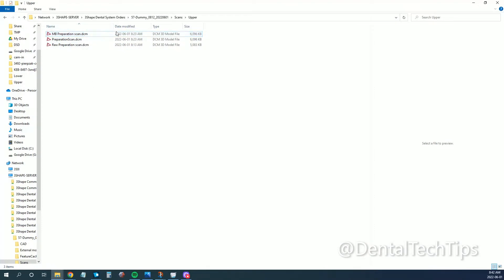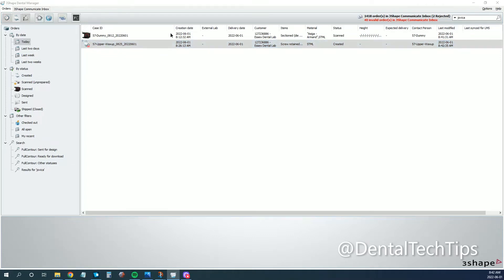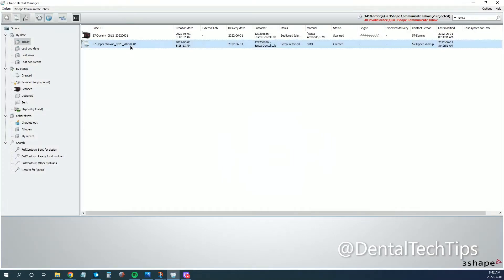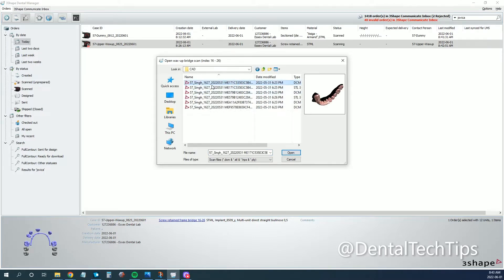Now that we have this file, we're going to note where it is and go ahead and create a new order. I've already created it, but you want to make sure your order form corresponds with your previous ones — you want those same teeth positions selected. You choose Direct to Multi-Unit, select Wax-Up Bridge, and hit OK. Now we're just going to import our objects. We grab that MB Preparation Scan, then we grab our wax-up as well — go to the CAD folder, go to the upper, and hit OK.